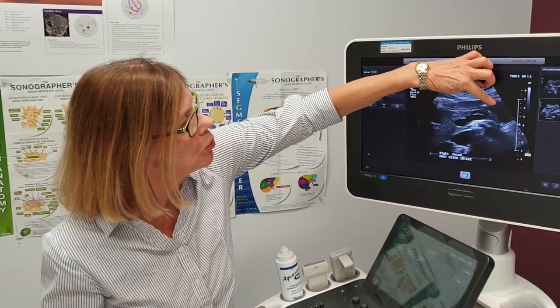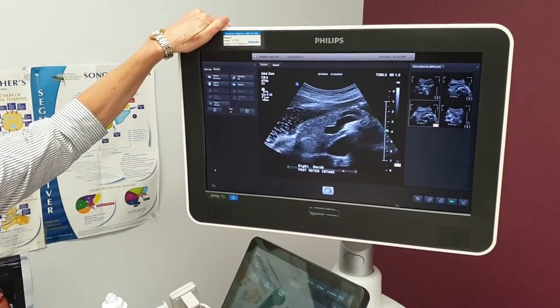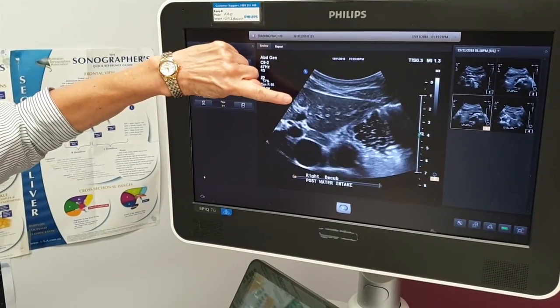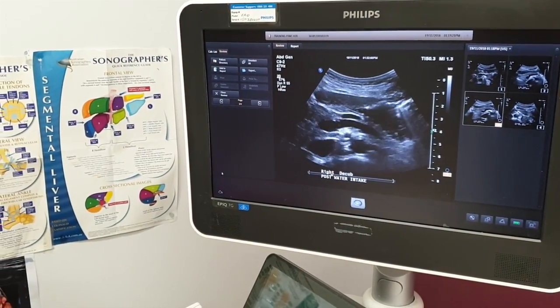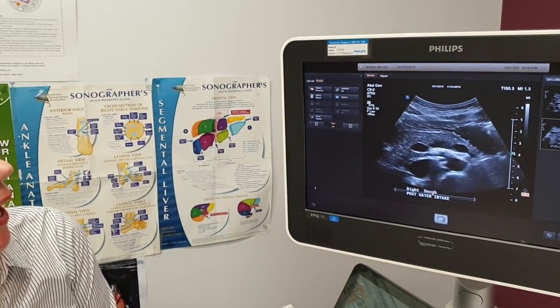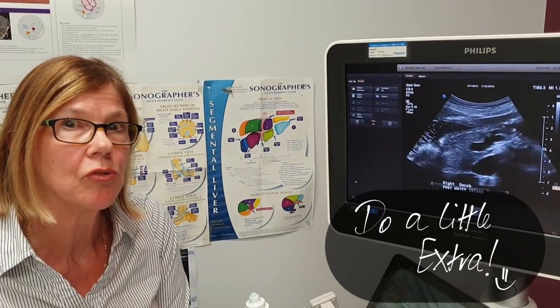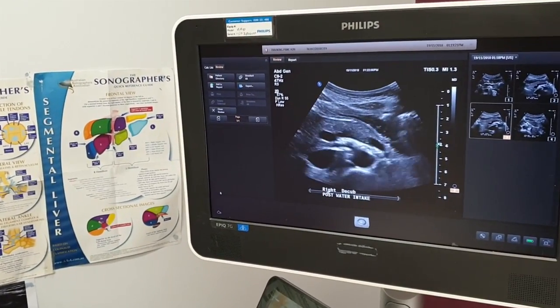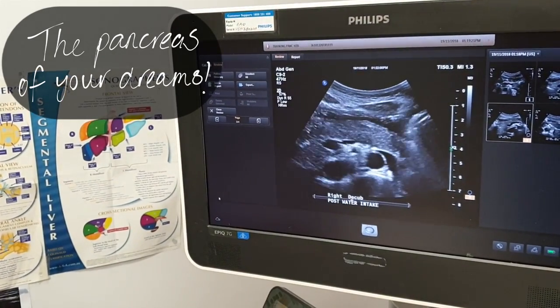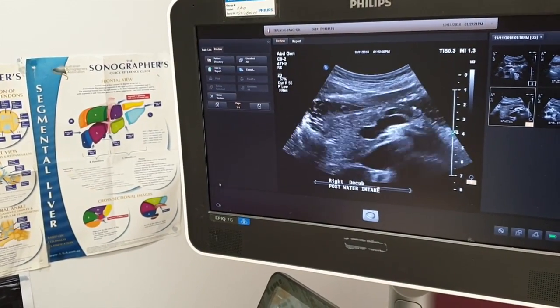If that doesn't work, fill them with water, because if you fill them with water the stomach wraps around into the duodenum and it just gives you a nice outline. Here is the stomach with water in it — I've just rolled the patient onto the right decubitus and you can see that the stomach actually gives you more of an acoustic window to look at the tail and then around to the head. It's worthwhile if you can't see the pancreas really well, especially if there's concern about a mass in the tail or the head. Isn't that the most beautifully seen pancreas? Check that out!